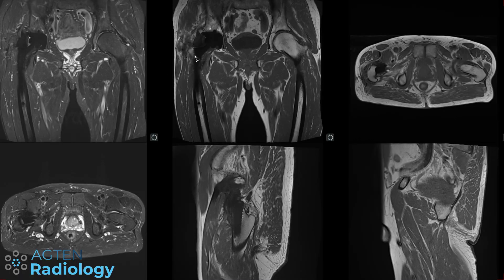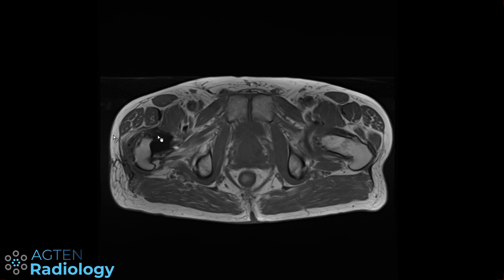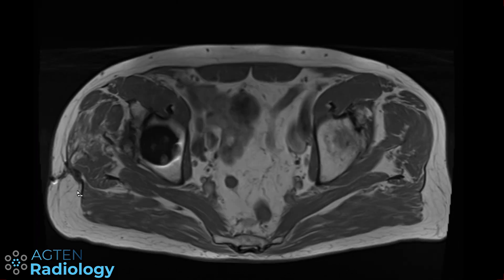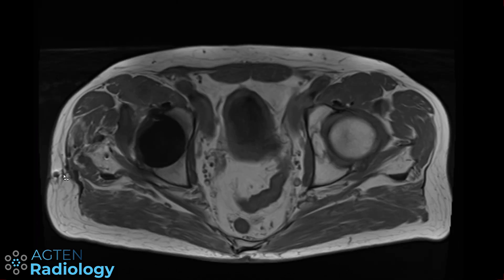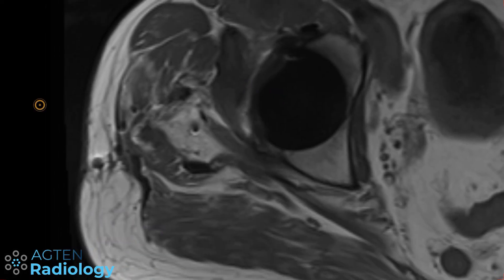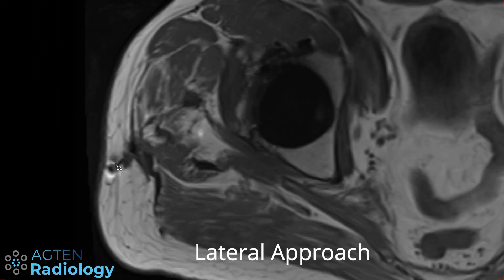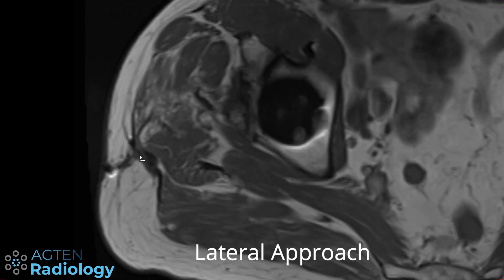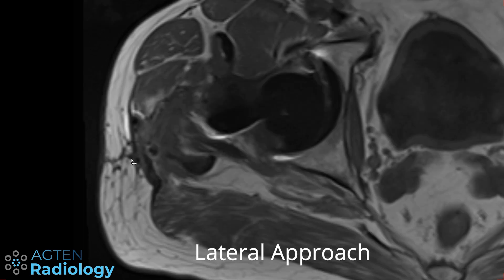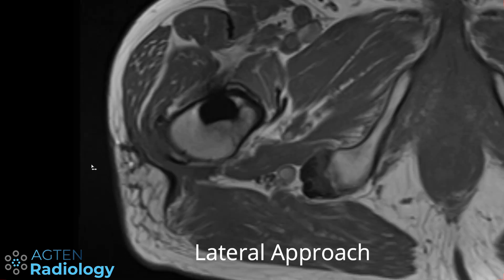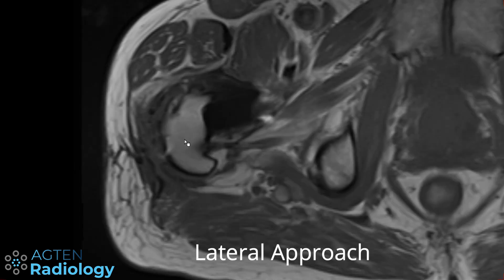To identify the surgical approach, the best strategy is to use the axials. As you scroll through, what you're looking for are these tiny little susceptibility artifacts. You can see the typical susceptibility artifacts here along the surgical approach, and you can immediately see that this surgical approach was a lateral approach.